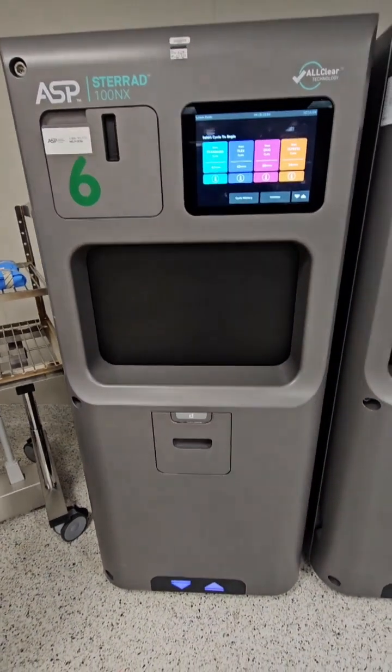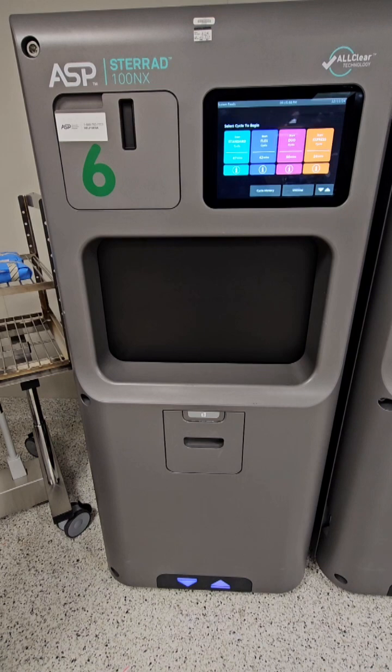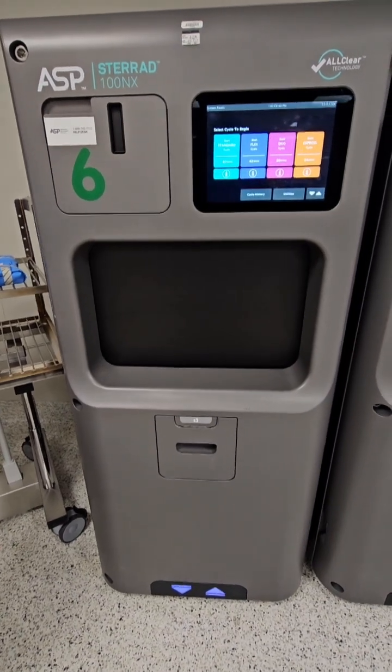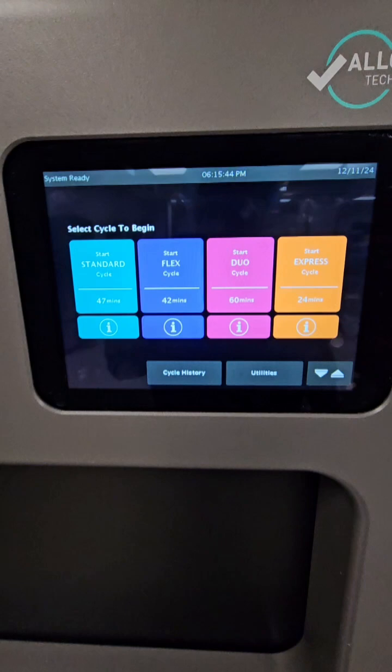What's going on guys? Welcome back to WDYD CSP — What Do You Do as a Central Sterile Processor. This is going to be my tutorial for the ASP Sterrad 100 NX with all-clear technology.